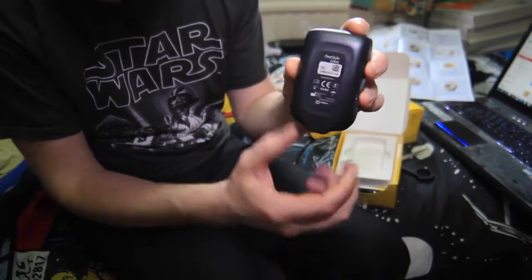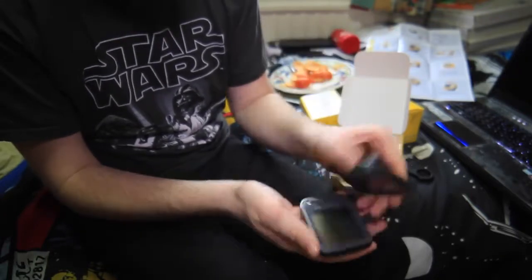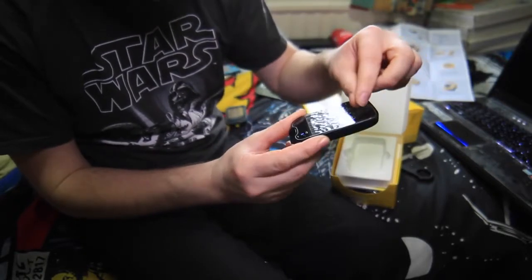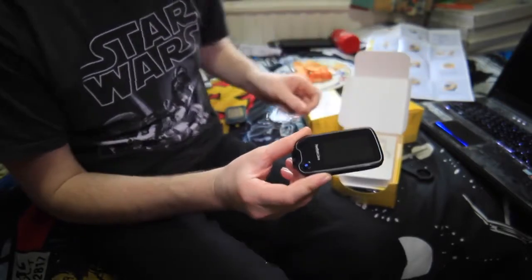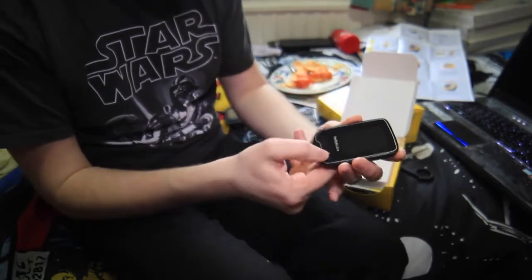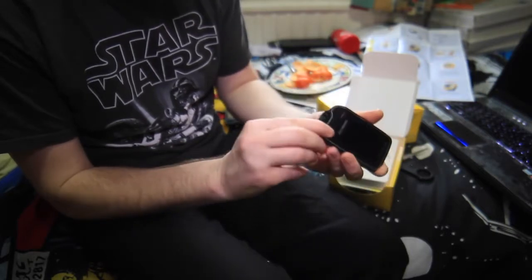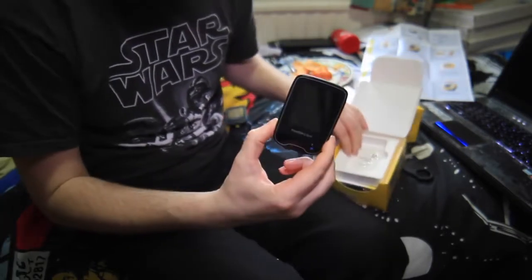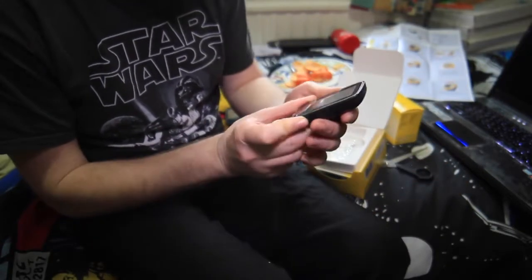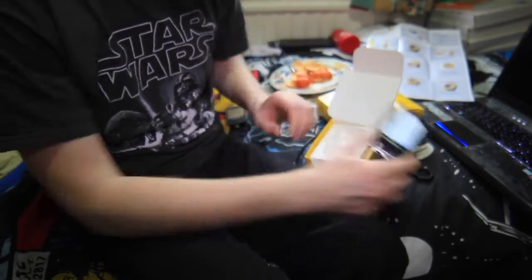It comes with a protective cover, so I'm just going to take that off. Checking if it's charged up — doesn't appear to be, no battery power at the moment. Oh, hang on — here we go, it's starting to turn on. It's just asking me to put some settings in, but let's look through the rest of the box first.